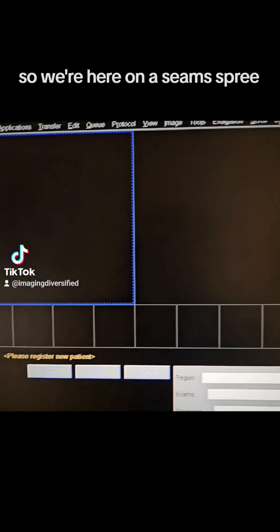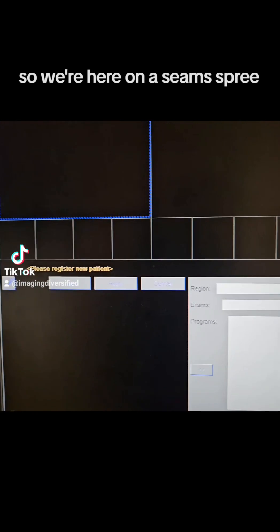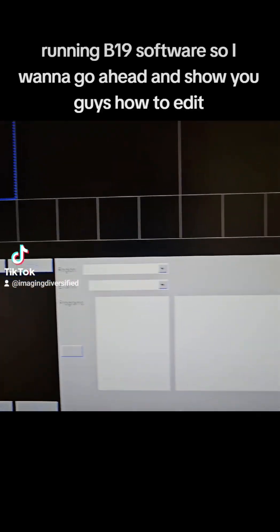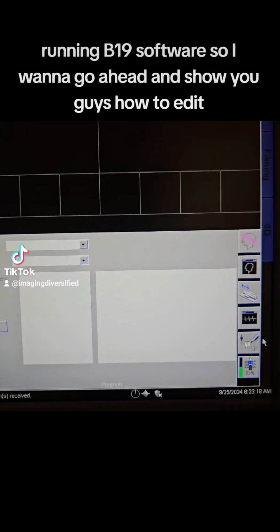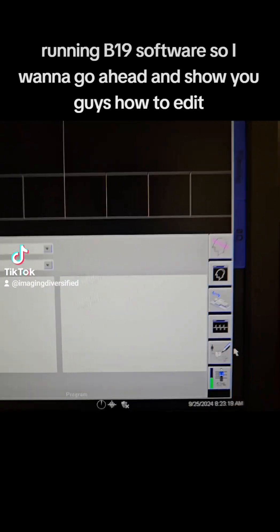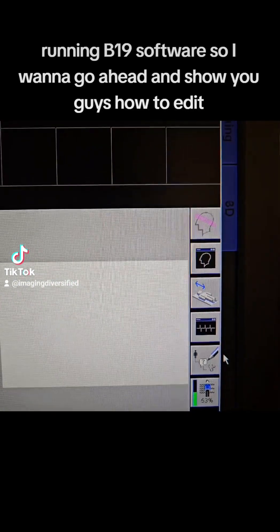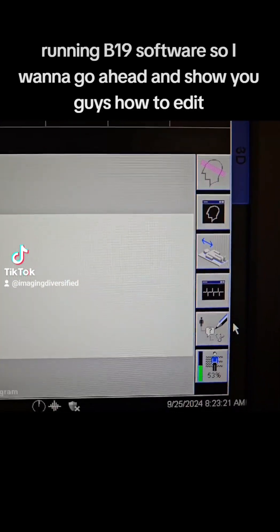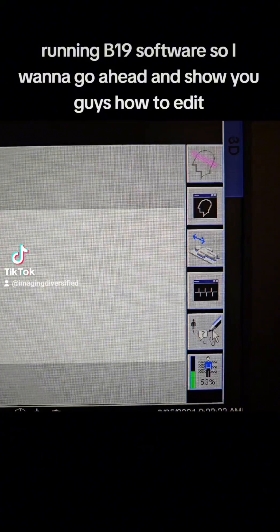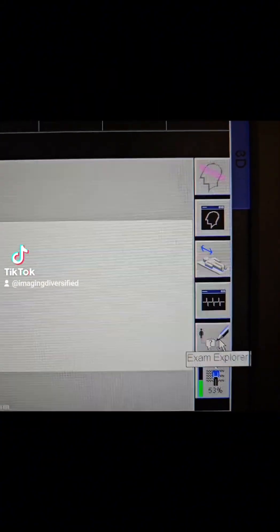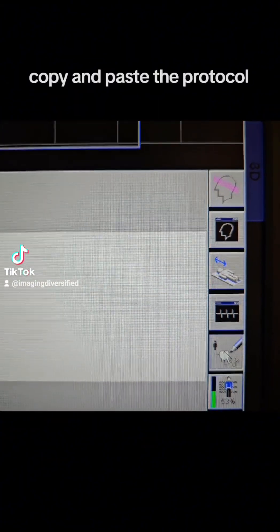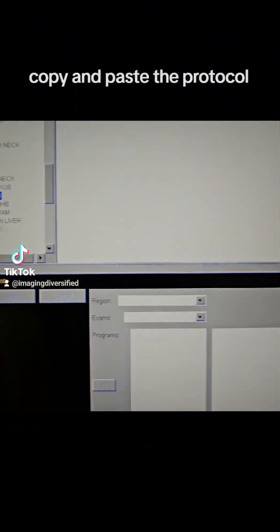Hey guys, so we're here on a Siemens Esprit running B19 software, so I want to go ahead and show you guys how to edit, copy, and paste the protocol.